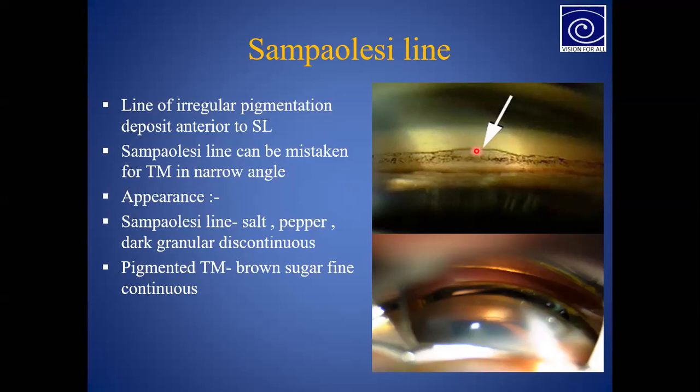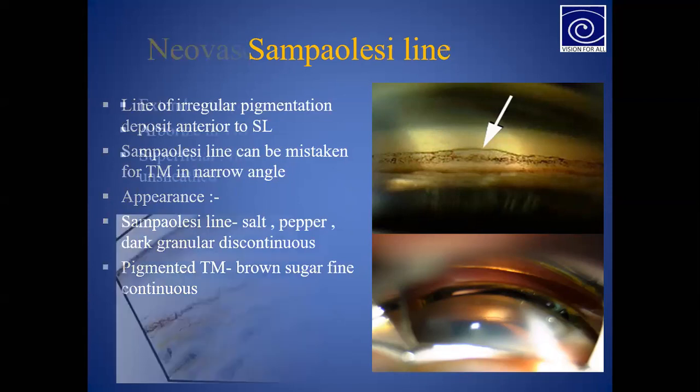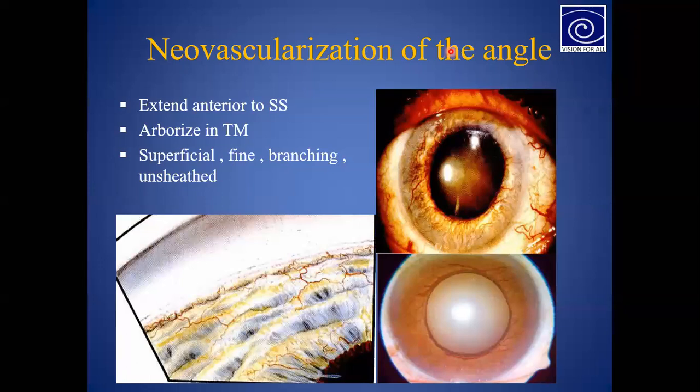मैं गलत बता रहा था. ये trabecular meshwork का anterior ही रहता है, बट ये क्या होता है कि Schwalbe's line का भी पहले ये दिखता है. ओके, उसके बाद में Schwalbe's line दिख रहा है यहाँ पे, this whitish band, and उसके बाद में this your trabecular meshwork. तो ये कुछ इस तरह के लाइन दिखेगा. तो बस नाम जान के रखो आप लोग अभी के लिए, otherwise Sampaolesi line का ही अलग एक चैप्टर है.